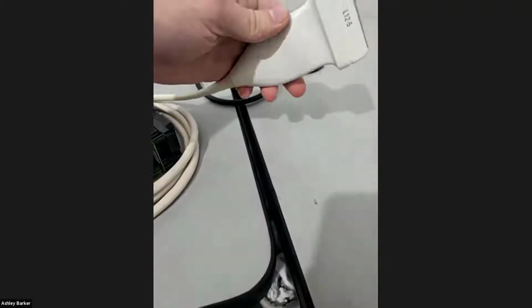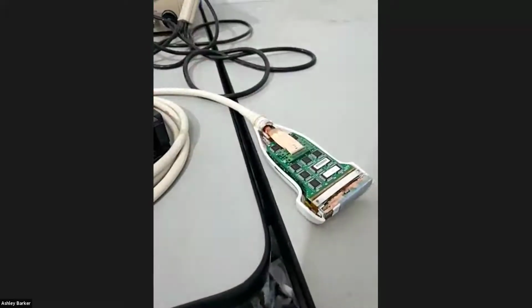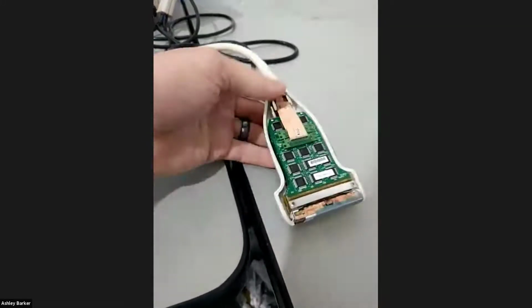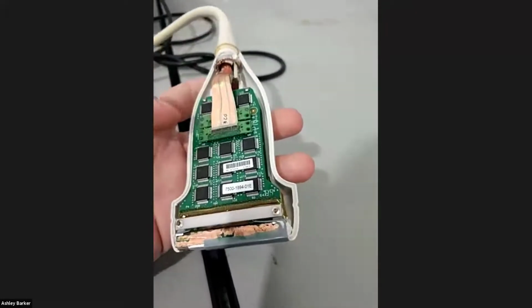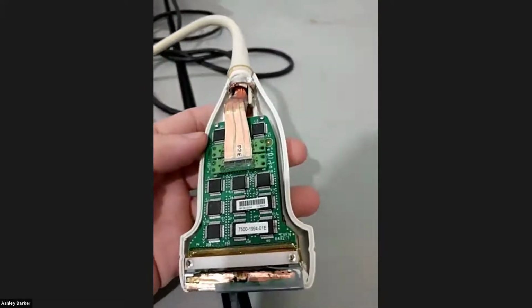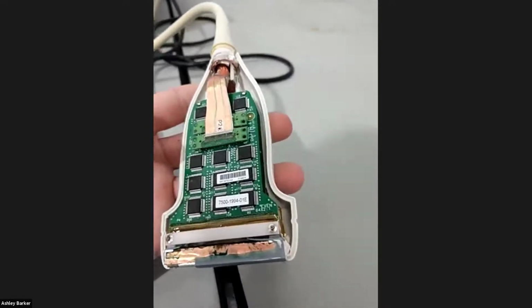It is an L12-5 Philips probe that we have pulled apart for the purpose of you being able to see what's inside. You can see in the head of the probe up the top here, there's a whole bunch of circuitry. Some probes will have this circuitry, some won't. The reason that this one does is it's multiplexed. So when they say a probe is multiplexed, this is basically the components that are doing that.